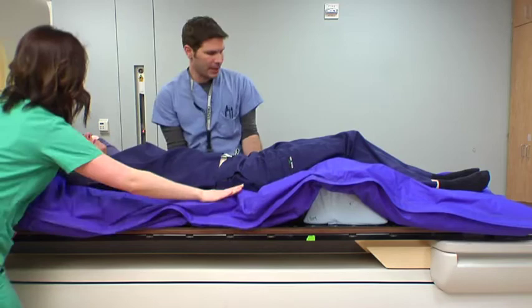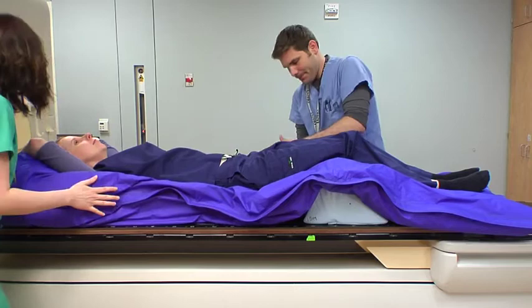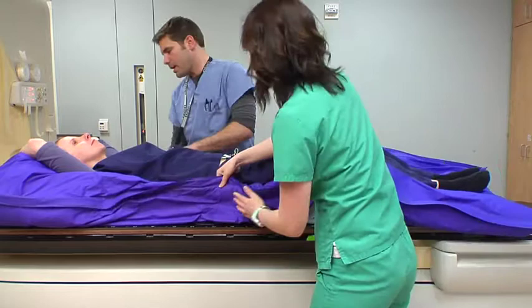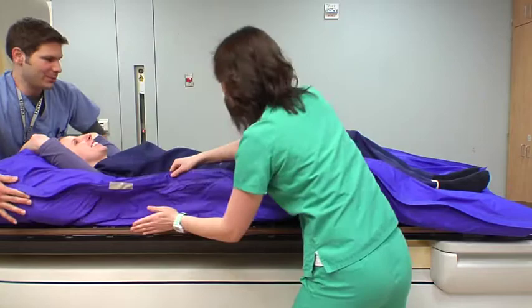We're going to try to bring it up on the sides here too, just to kind of get the contour of your body. We're going to kind of push it in over here, and we're not trying to hurt you on purpose — we're just trying to get into it so it will fit through the core of the machine.